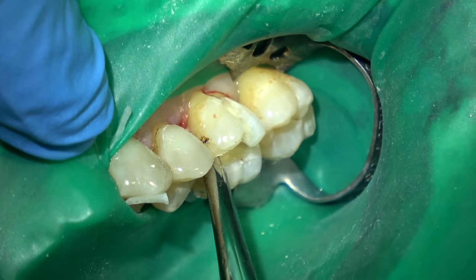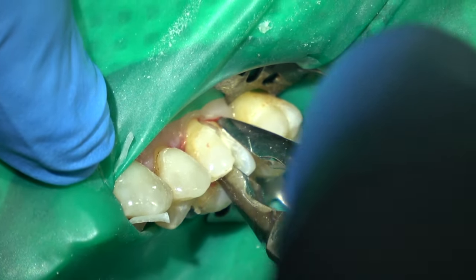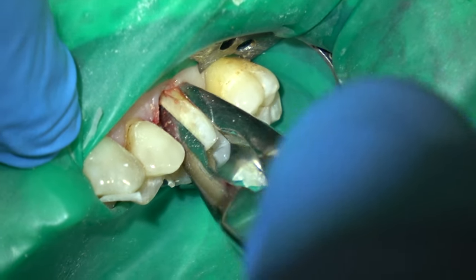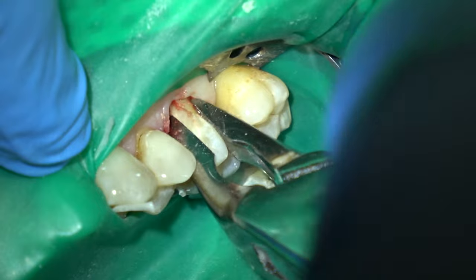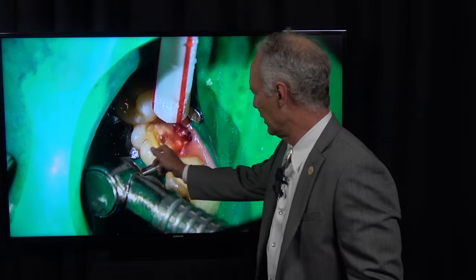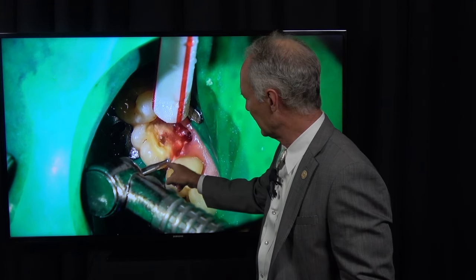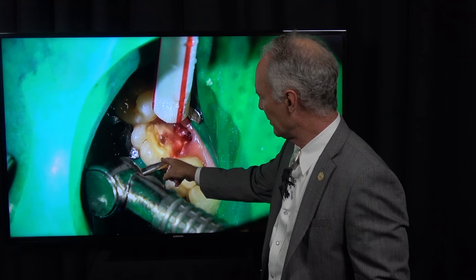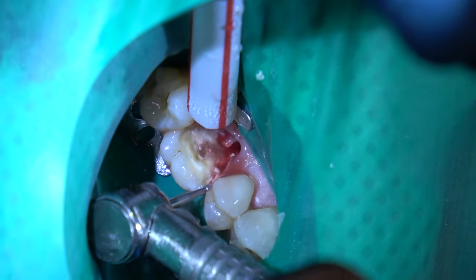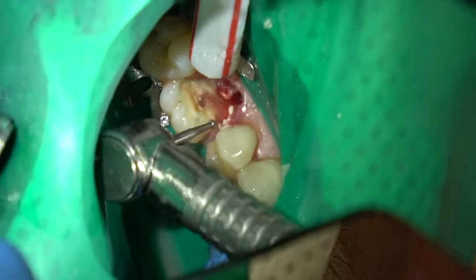I'm just gently torquing those, then corkscrewing each root out — not moving it to the facial because I want to preserve the buccal bone. Now I'm creating a little space so I can turn this root and just unscrew it, making space between the palatal root and the bicuspid and between the palatal root and the second molar, so I've got a little room to elevate or unscrew it.